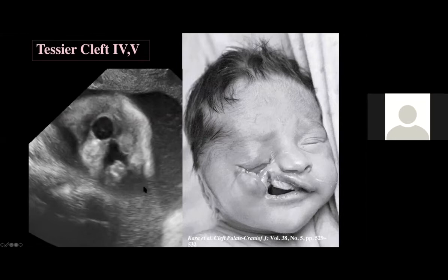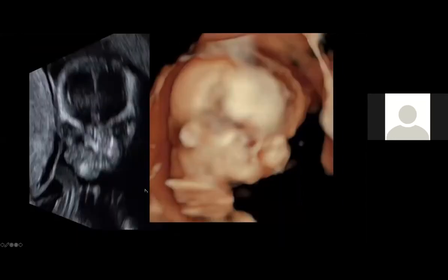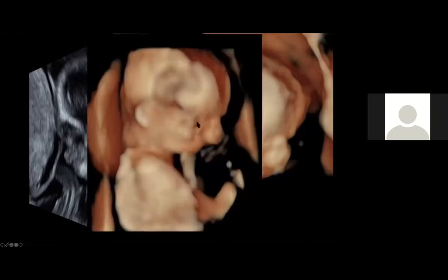This is a third trimester example, but we did see it in the first trimester. This is a first trimester example of a Tessier cleft, where you see that the cleft goes from the orbit into the mouth right here, with some micrognathia as well. And here it is, the cleft just on one side.